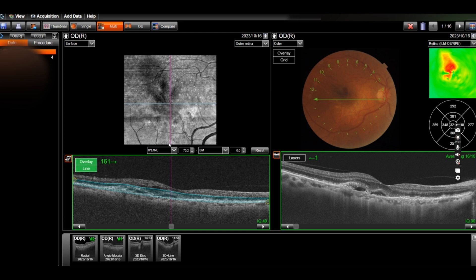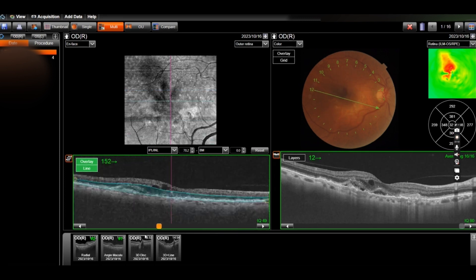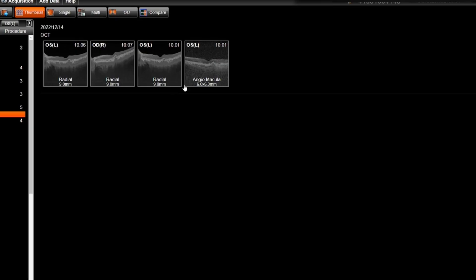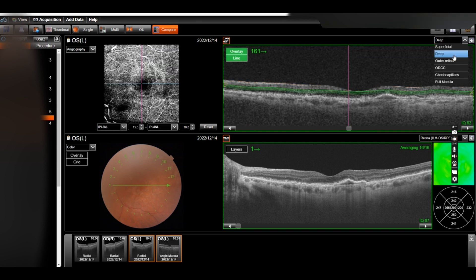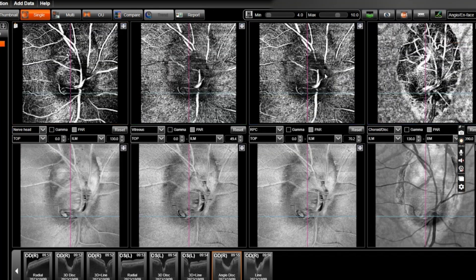There's also a third view which combines a great feature of ImageNet: you can have the high-resolution B-scan together with the OCT angiography — a multi-imaging view. This is very useful because the B-scan from the OCT angiography is not so high resolution and sometimes you want to see details. We can change color between black and white, invert, and color, and we can also change the aspect ratio for B-scans. If you have multiple visits you can compare them using the comparison option, and you can also change the segmentation.